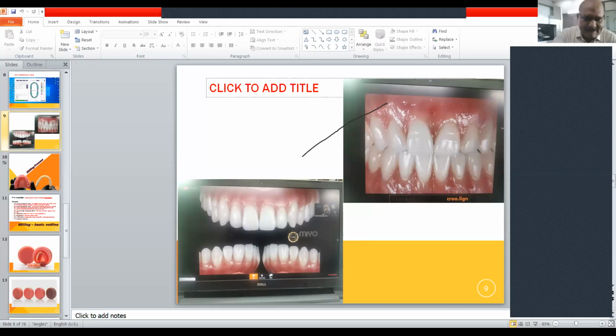Swati, your choice. I missed the question. My question was, doctor, that since you can see the model, which has 4 implants placed in the mandibular jaw, according to the height availability or the decision of the clinician, we can go for a cement retained PFM bridge, or we design a bar, mill it in titanium, a screw retained bar, and use that bar with the spikes to prepare a hybrid denture.